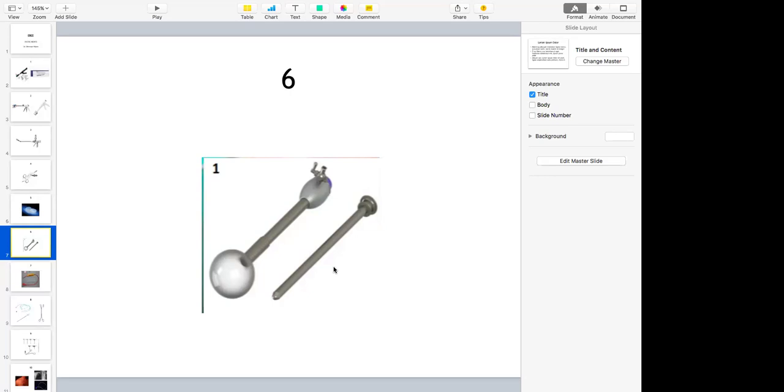The problem with ethylene oxide sterilization is that there are toxic effluents, toxic gases. So there has to be a proper way of disposing that gas through a proper chimney, because if that is inhaled, it is toxic. So to have an ETO setup is difficult. So plasma. And what about chemical sterilization?